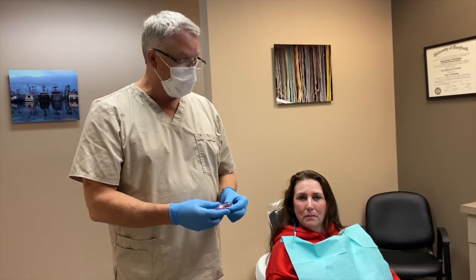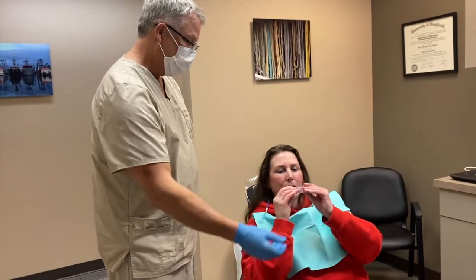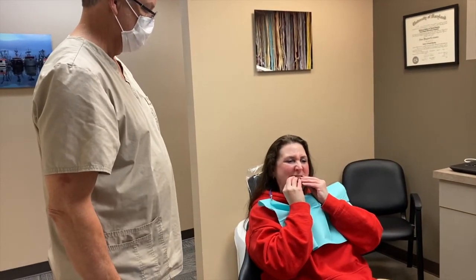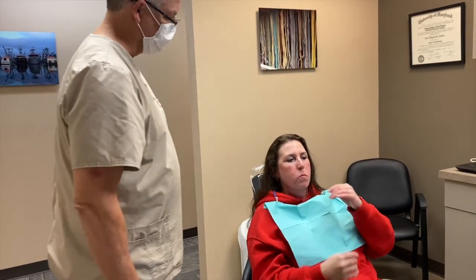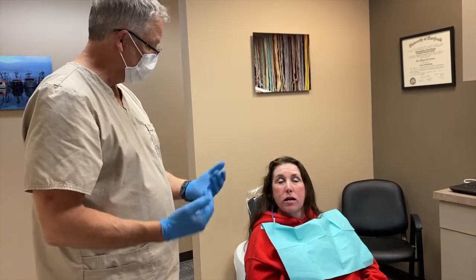We're just going to have Judy place it in her mouth. Does that feel pretty comfortable? Can you feel it holding your jaw forward just a little bit? Does it feel excessive? No.